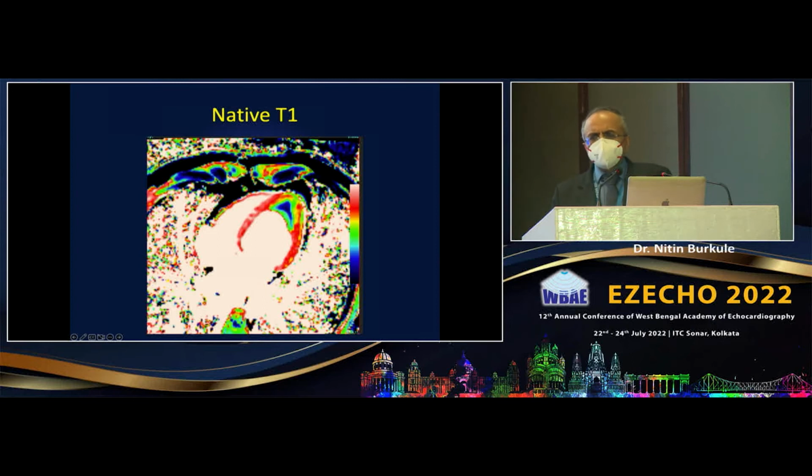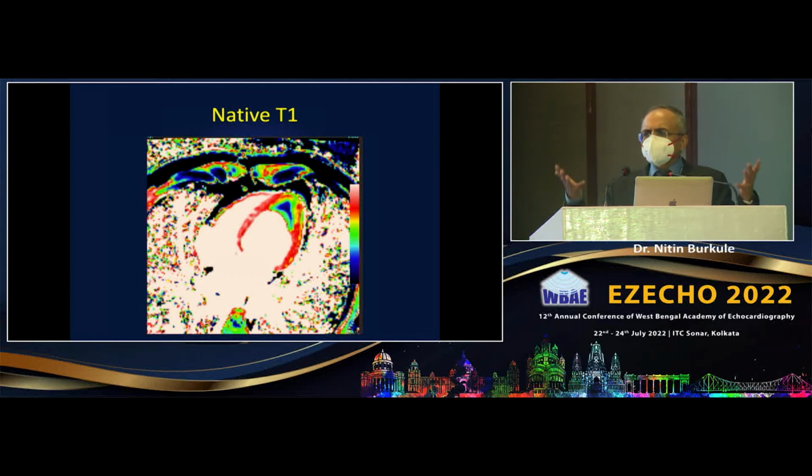This can happen only if there is some paramagnetic effect, and that is the heme. So that means this is the red clot where some of the RBCs are lysed and the heme is out, and that is bringing down the T1 values, and you can literally see the heme there. So that is how we knew the tissue characterization of this.